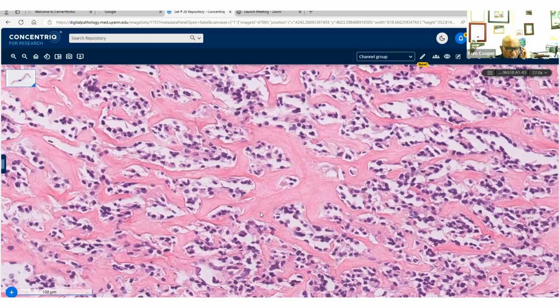Is it mesenchymal? Is it smooth muscle? Is it endometrial stromal? And then these other 3 tumors that I've mentioned, to think about those as well. I'm not going into the endometrial stromal because that's a different discussion, low grade and high grade, and all of the molecular profiles thereof. That's another fascinating discussion. But just for PEComa, you're absolutely right. This is not the usual morphology for PEComa. This is unusual, but that's the reason I'm showing it, because it's unusual. And the first speaker, I think, was Dina, I may be wrong, who suggested PEComa. So spot on.